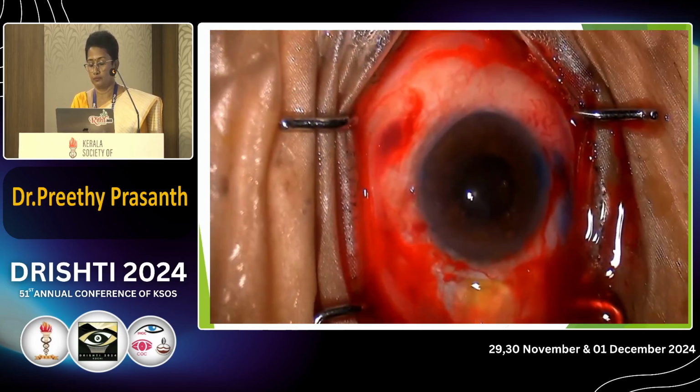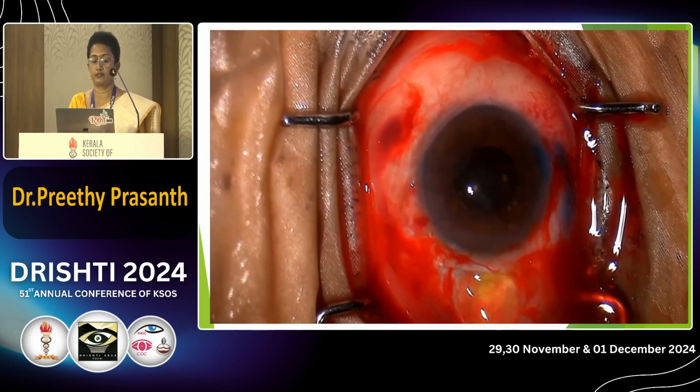And once you have a rectus suture, your assistant can slowly release it after the nucleus has been engaged in the tunnel. While you are withdrawing, the sister can slowly release the rectus suture. This is all for beginners.